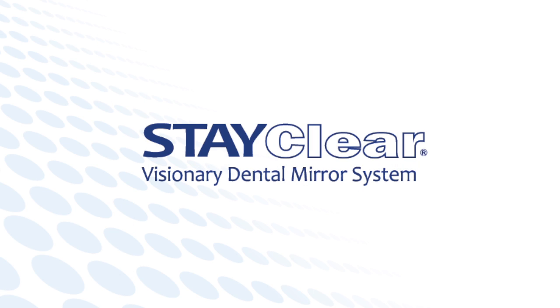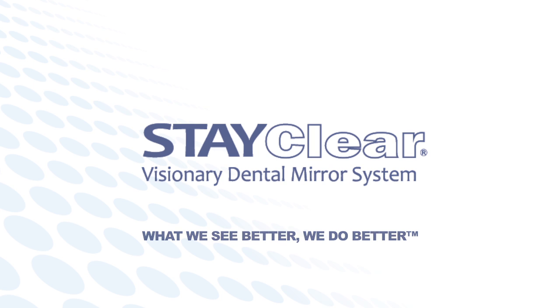The StayClear Visionary Dental Mirror System. What we see better, we do better. StayClear.